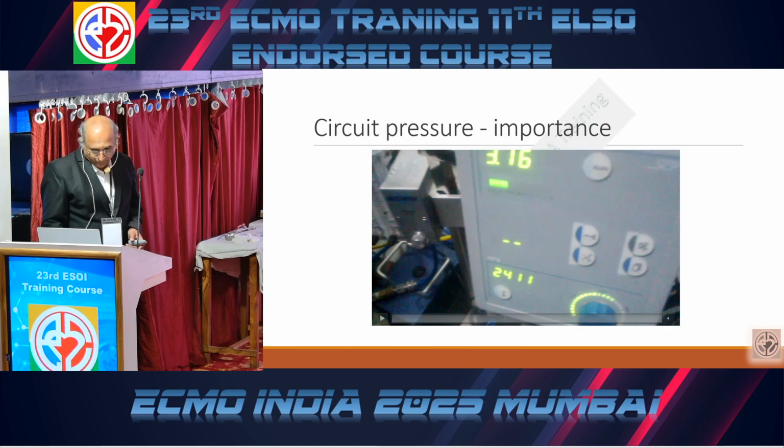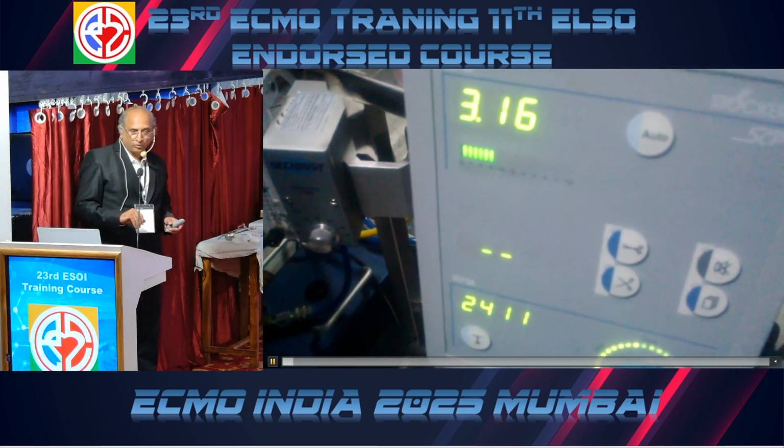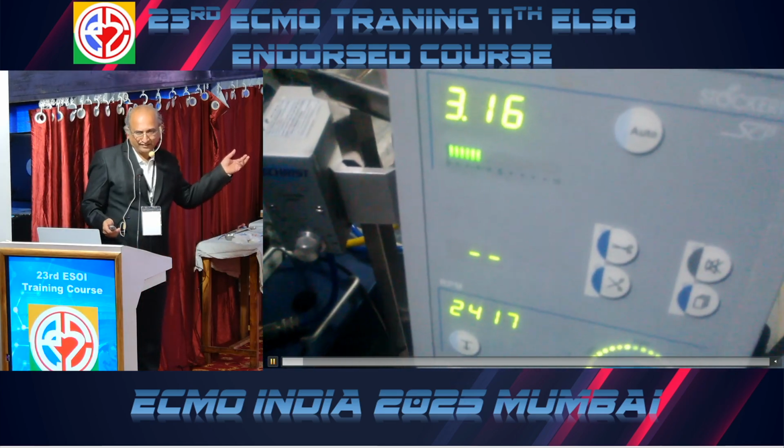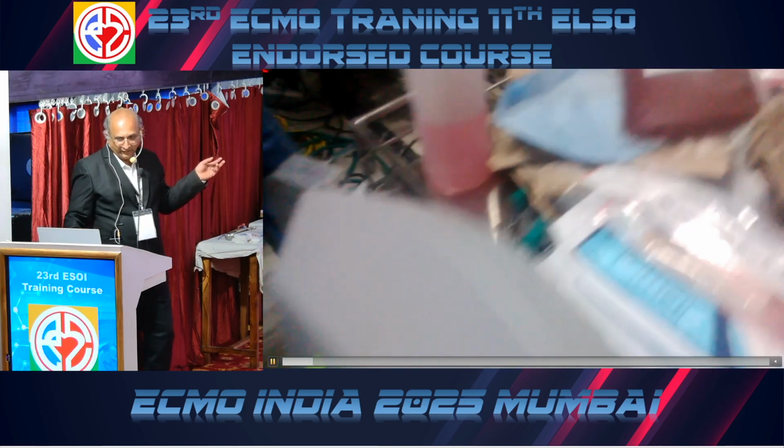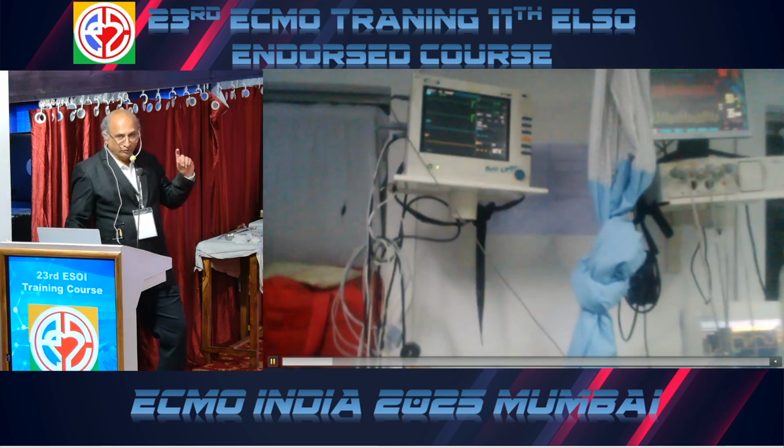This is a young patient of 24 years, dengue, ARDS, put on ECMO. This is day 12 or 13 of ECMO. He started improving, and we started coming down on ECMO flow. Just keep a watch on the videos, okay.